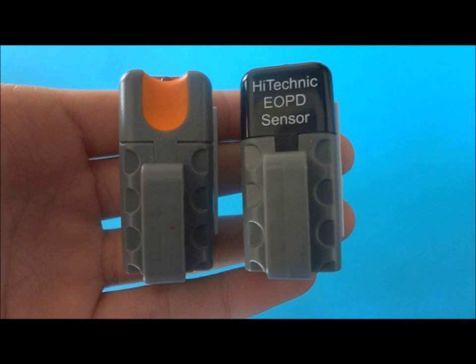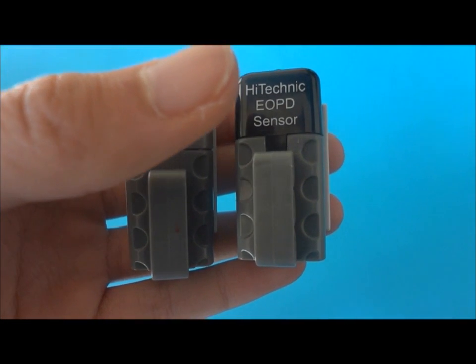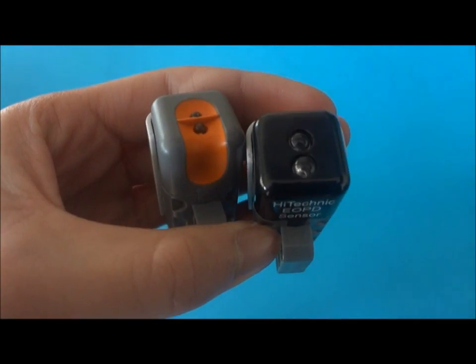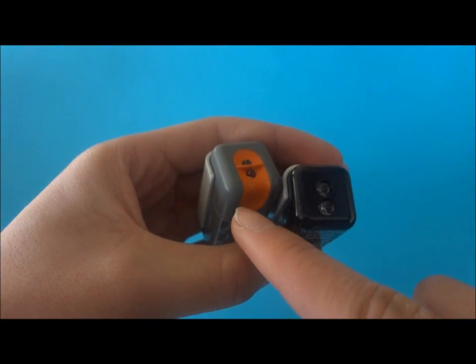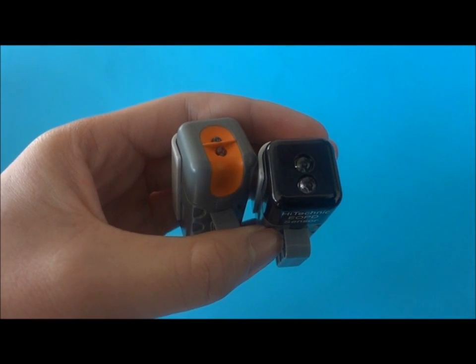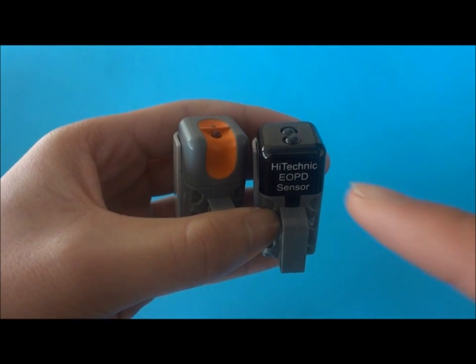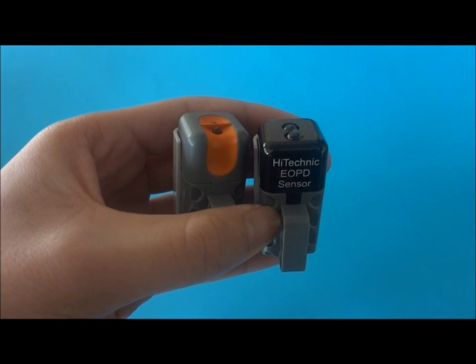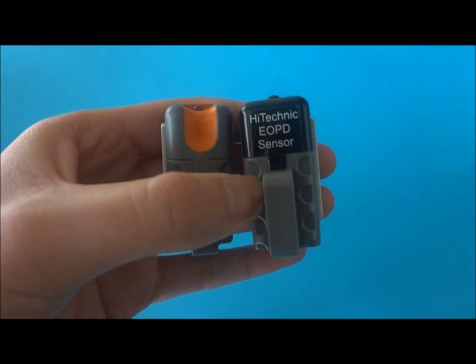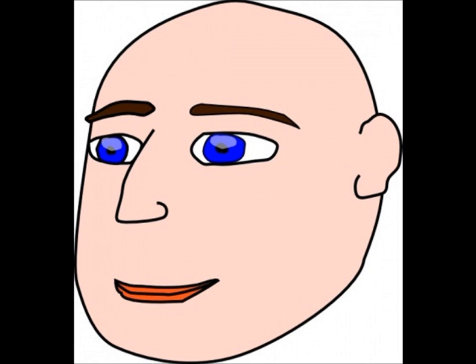I also have two light sensors, one each from Hi-Technic and Lego. Both can measure distances using reflected light and are very accurate. However, the Lego light sensor is very sensitive to changes in ambient light, and so we have problems going from indoors to outdoors. The Hi-Technic one uses pulse light, which is insensitive to ambient light changes. This, we thought, was the best so far. I can use the eyebrow to control the wheelchair.